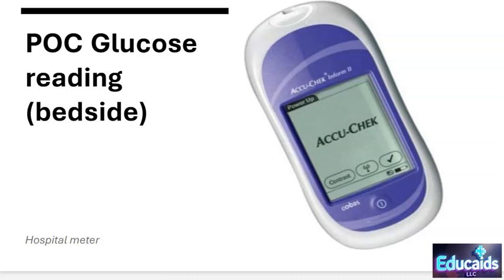So with our glucose readings in the hospital, anytime you see POC, that means point of care. So that would be a bedside test. Anytime you see POC, that means we're going to do that test at the bedside. And often we do glucose readings at the bedside with our patients.